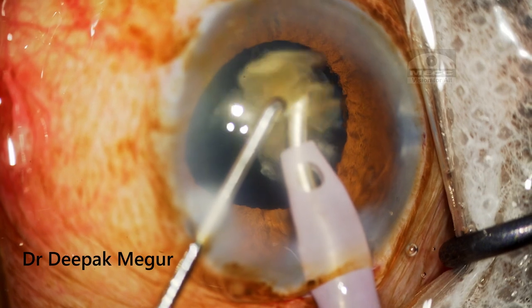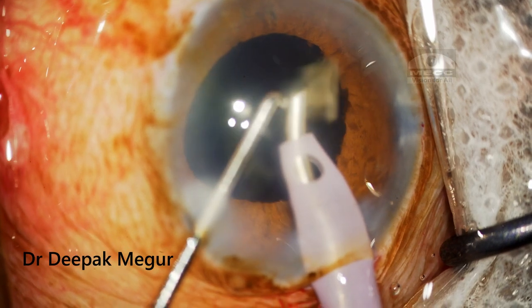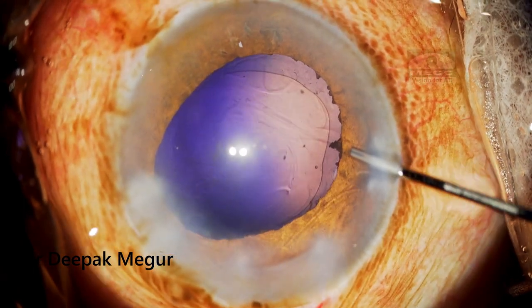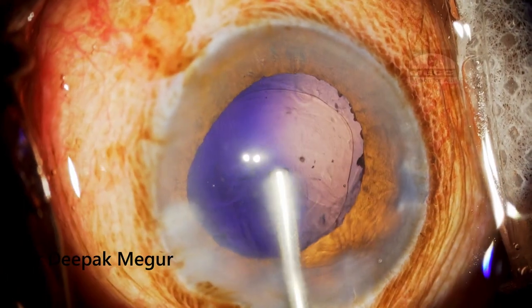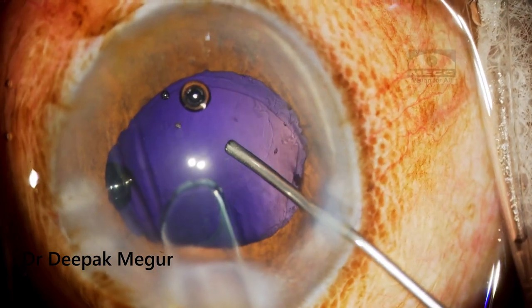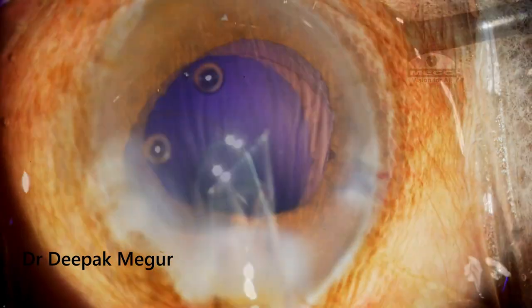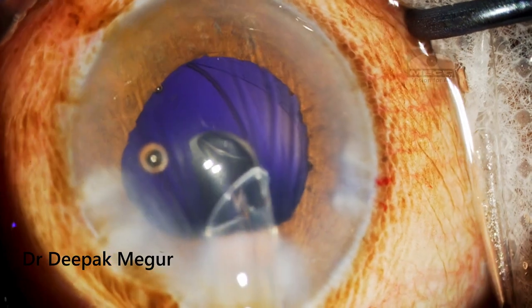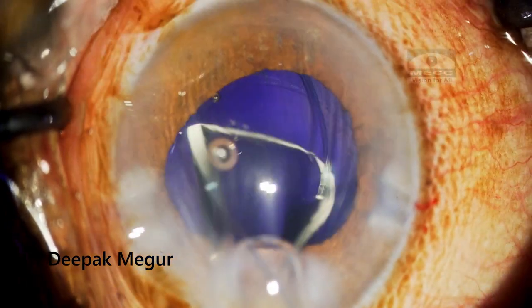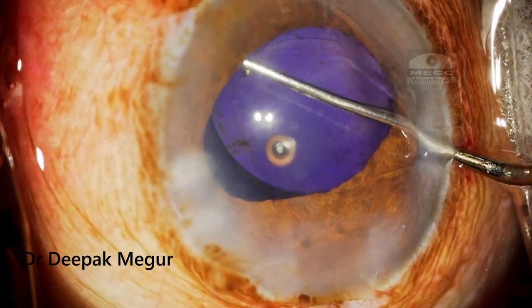Once the nucleus fragment is out, one important observation is that the red glow is completely absent and instead we are seeing a blue glow. The reason is that Trypan Blue has migrated into the posterior chamber, probably into the Berger space, which is testimony to the fact that the trans-zonular barrier is quite permeable to fluid, especially in eyes with generalized zonular weakness. The barrier is predominantly more in our mind than factual, especially in some eyes.